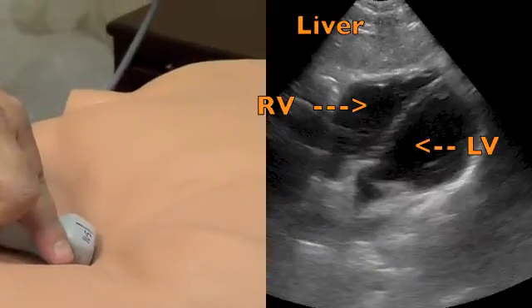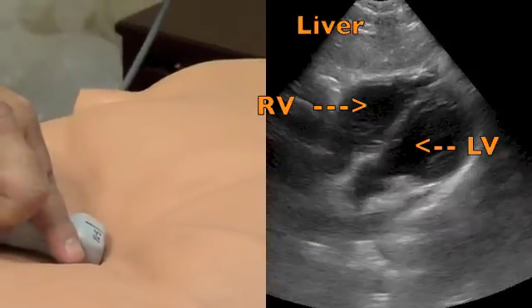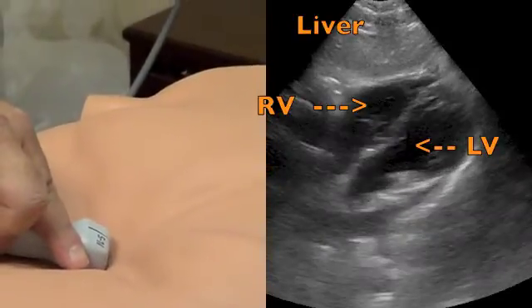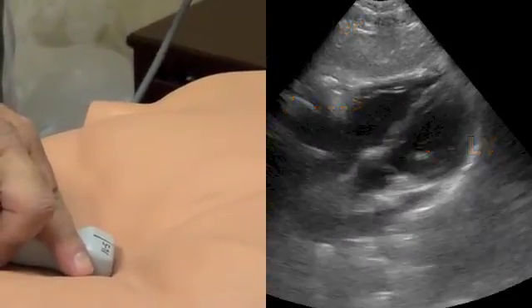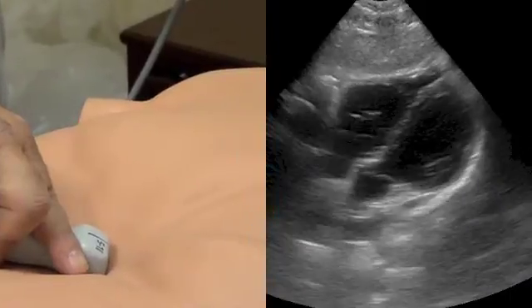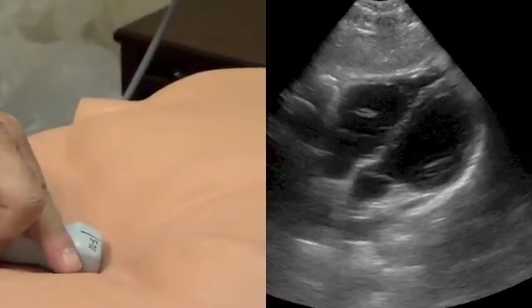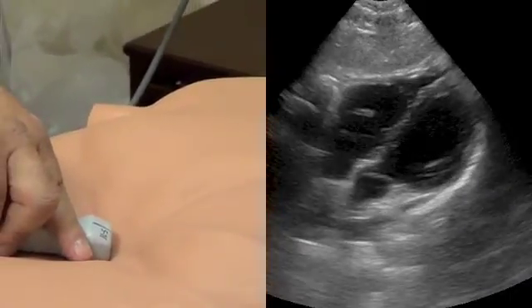When you're assessing the subcostal view, you always assess for cardiac motion and any pericardial effusion. And in this case, you're looking for right heart strain.